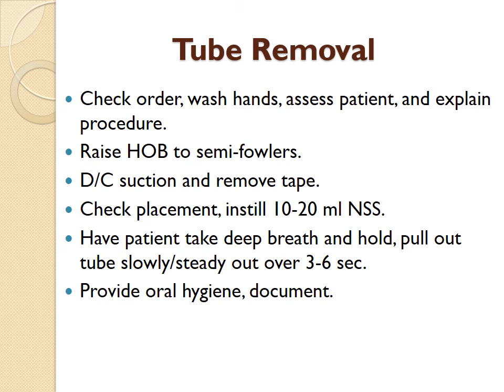And for checking placement there, I usually put a little bit of air in just to hear the swish, or I may take a little bit and check for the pH if it's ordered, again, per facility's policy. But when you instill the saline, the purpose is to get that stomach content back in the stomach now. We no longer want to be suctioning this stomach content out. You want to make sure that everything is back into the stomach and also that none of it is dripping out the end of the tube as you are pulling it out, because it's going to leave an uncomfortable taste in the patient's esophagus.